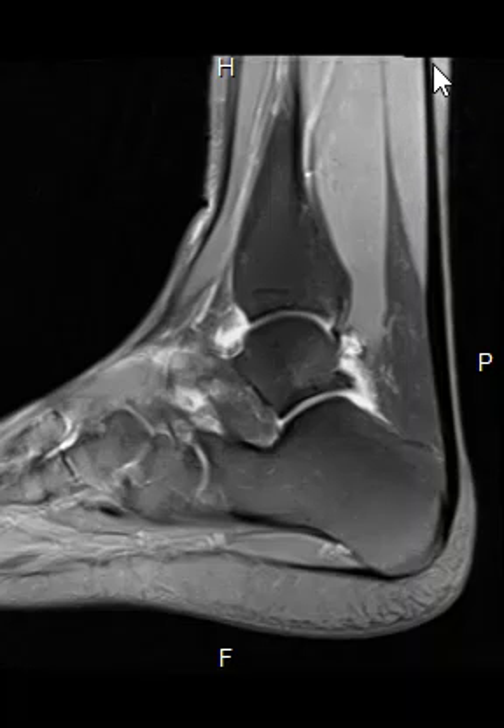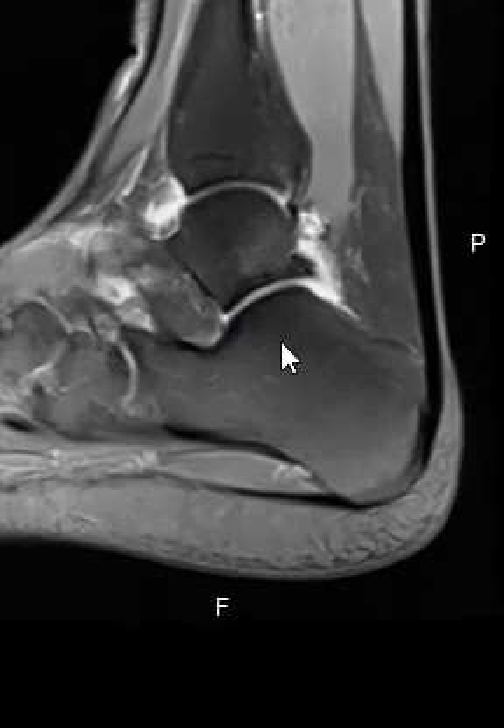The muscle ends and blends into this tendon. You have a central tendon, the muscle ends, and now the tendon comes down here and attaches on the back of this bone — this is the calcaneus, or the heel bone. If we zoom in, it just looks beautiful. You see a little fat pad in front that's dark.